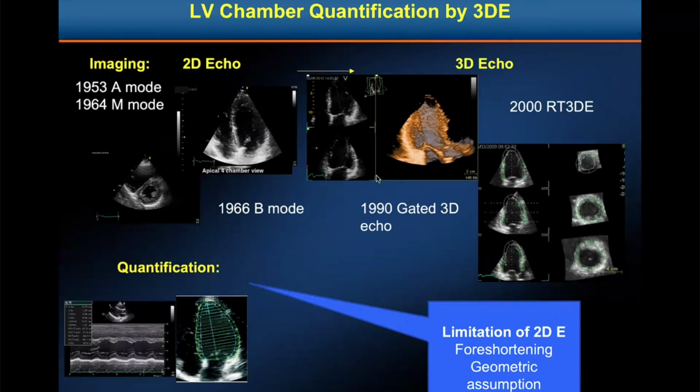The real-time 3D echocardiography actually has a history from the 2000s, and there is the possibility that we could quantify the function of the ventricles in novel ways.